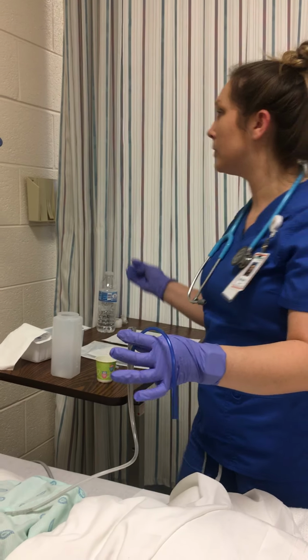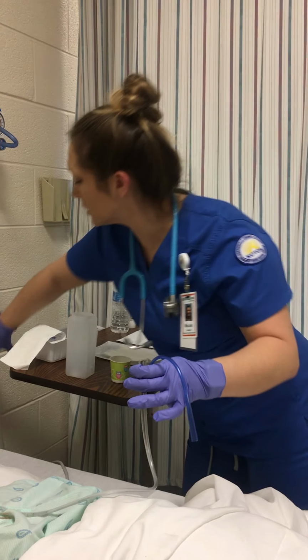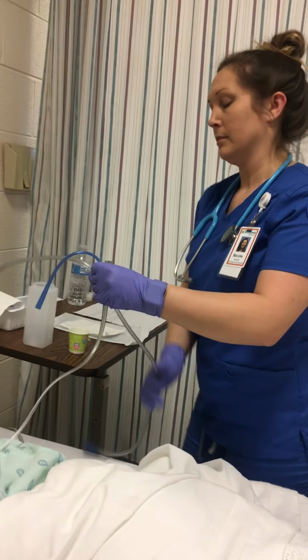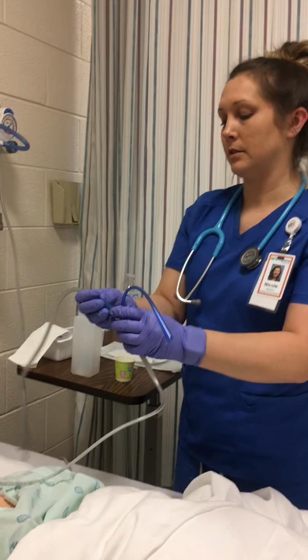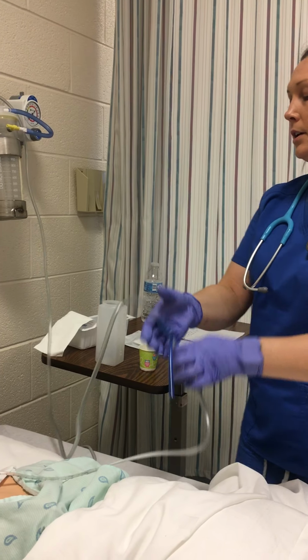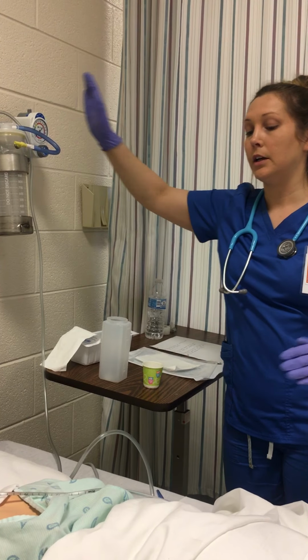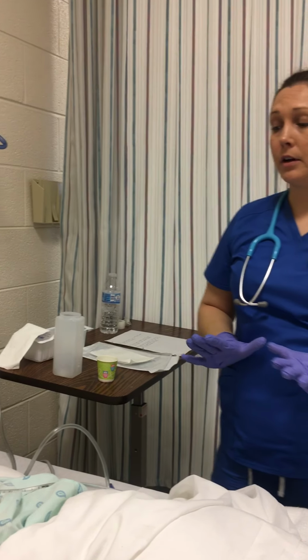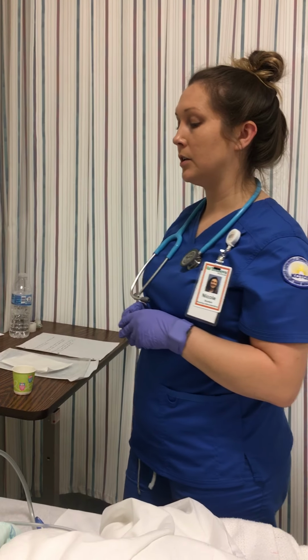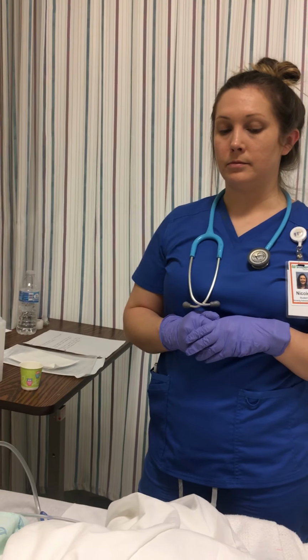At this time, you want to attach it to the suctioning. You want to set it to intermittent. You're going to assess the patient, make sure they're tolerating it well, that they remain in a high Fowler's position, or at least 30 degrees, and then document your procedure.